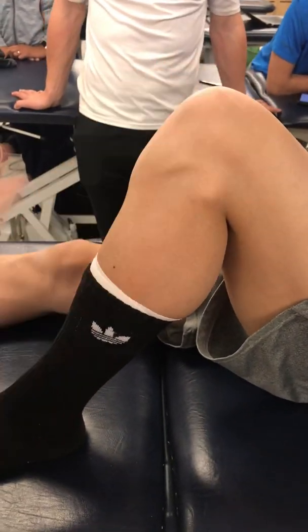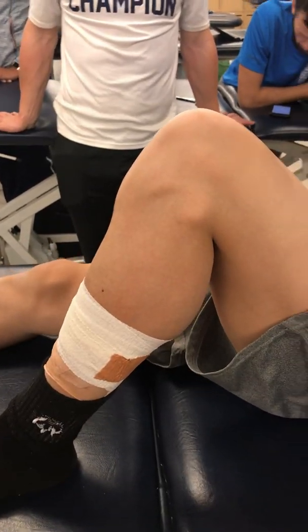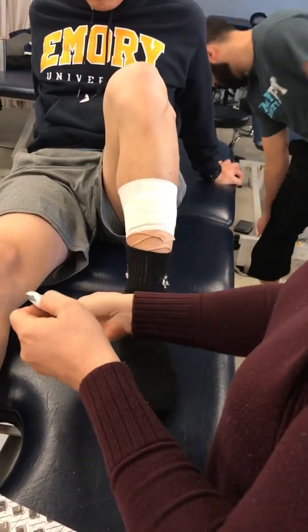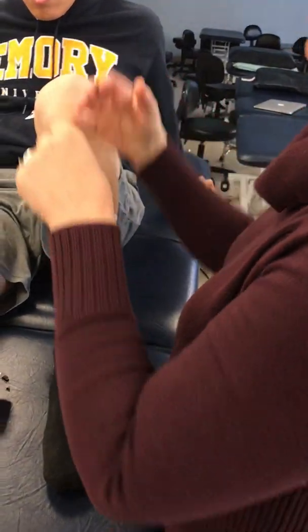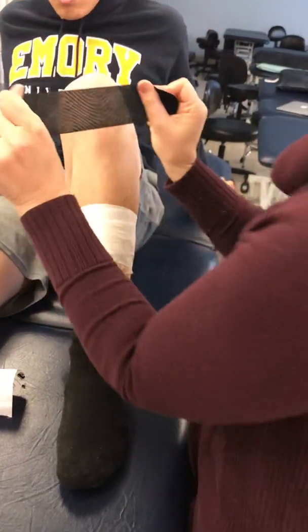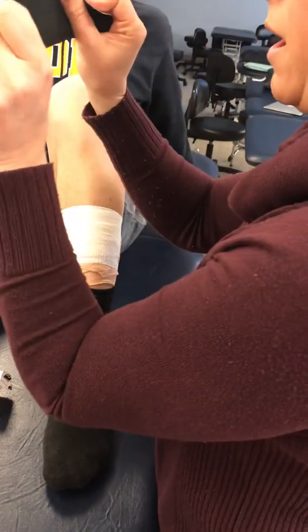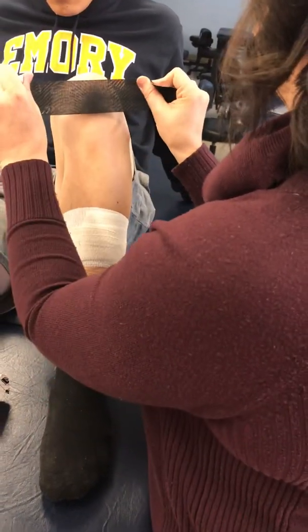So we're going to talk about patellar tendon issues. The two easiest things you could do for somebody with anterior knee pain by supporting them: the first easiest thing is to support the tendon and support the patella. We want to give this patella a little place to cradle itself into. We're going to do a full stretch. You see it? We're going to come up into pressing. So this is about 75 to 100%. We're going to push into the patellar tendon.